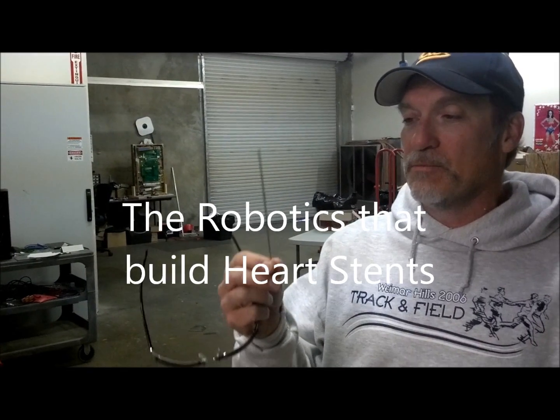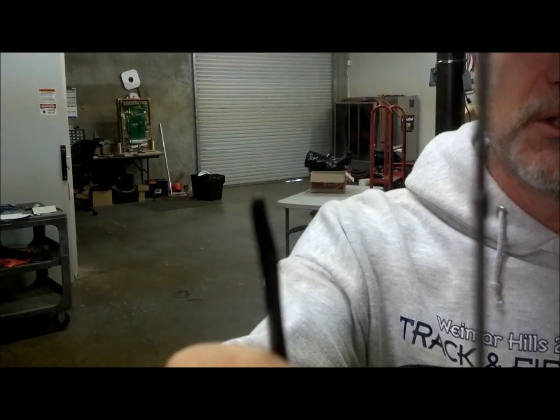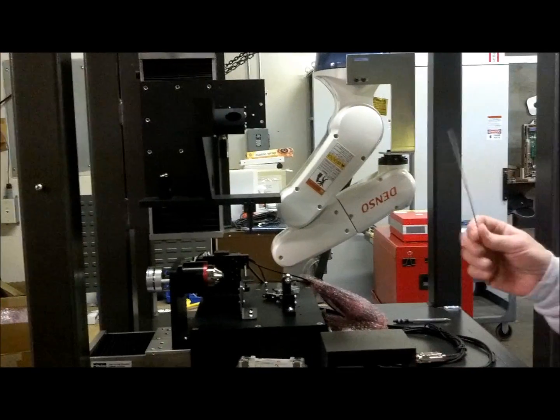These guys make stents for your heart. You can't really see it, but this is a heart stent here. What it is — it's a single piece of wire that's been bent in a sine wave, and we wrap it around this mandrel here. We use a fiber laser to weld it together.